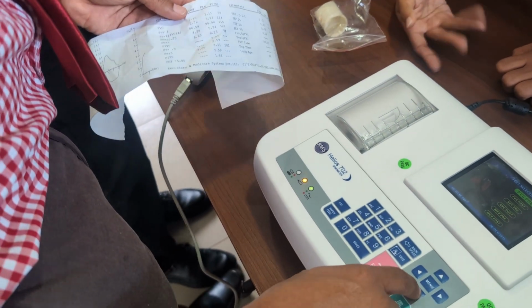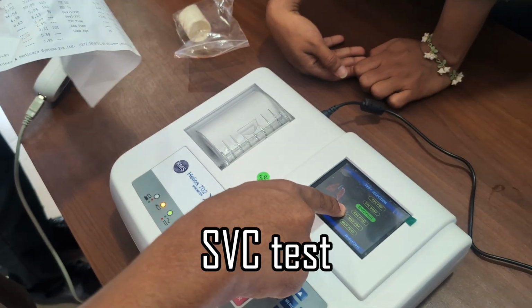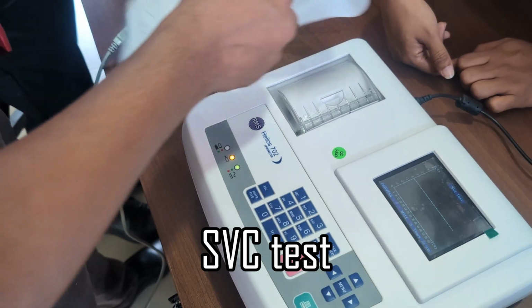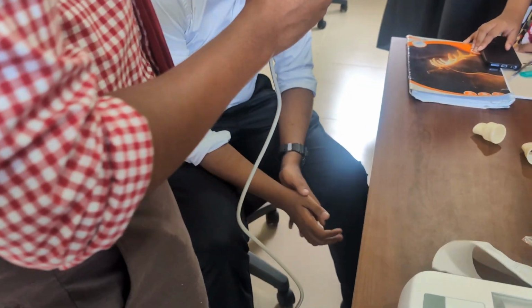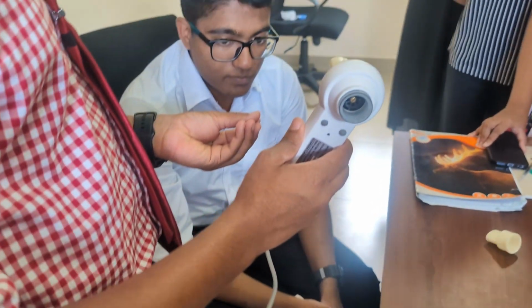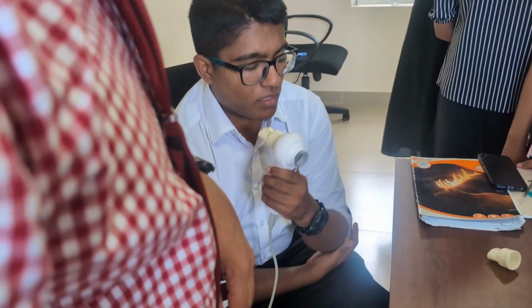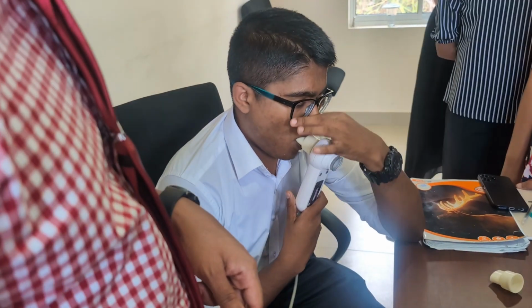So I'll move on to the other one, the SVC. This stands for slow vital capacity. If we go there, like before, you have to take a deep breath and breathe out, but you don't have to be as forceful as before, right? So it's not forced, it's just slow, right? So keep your mouth on the mouthpiece, and yeah, we'll start.